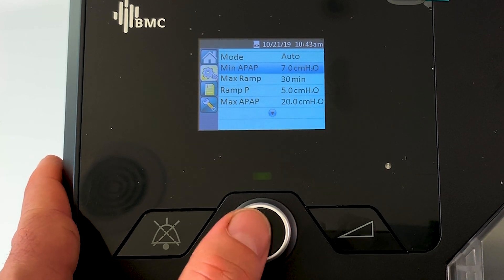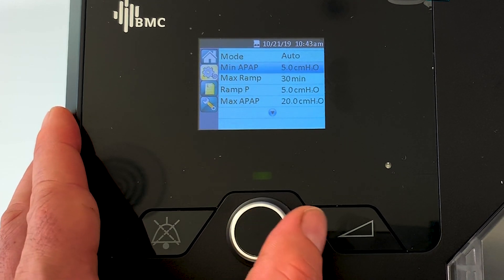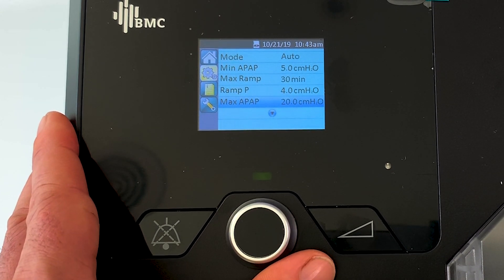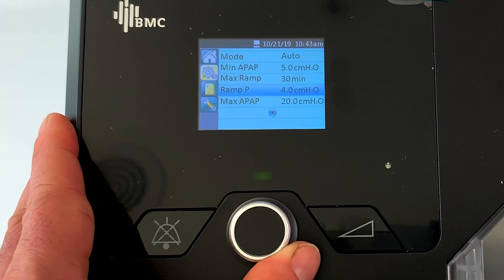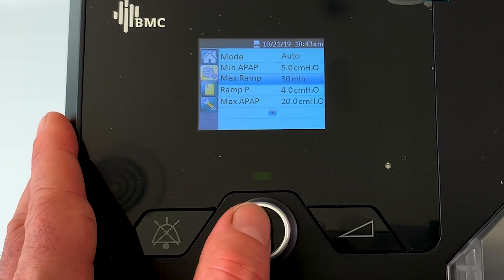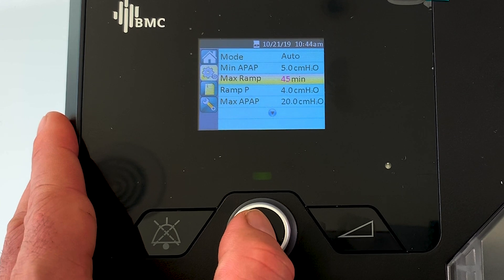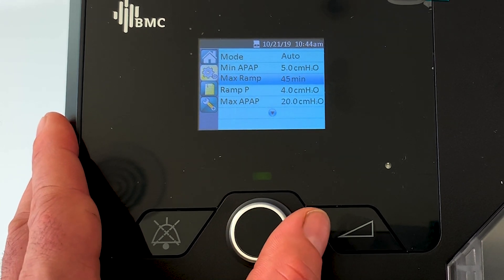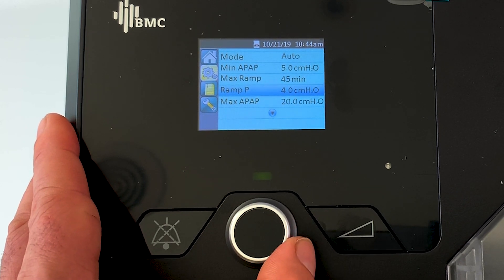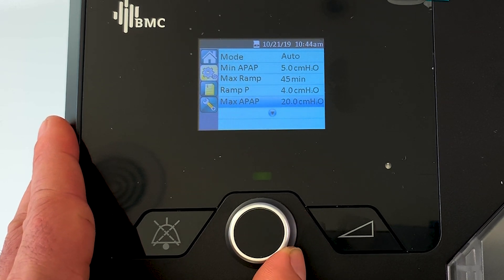I recommend starting with a min auto pressure of five, a ramp pressure of four, and you can leave the max auto at 20. In the patient settings you can change the ramp time. You can change the max ramp value here to 45 minutes if you think you need a little bit more time to get off to sleep. So over 45 minutes it will go from four up to five, then after that it will go between five and 20.